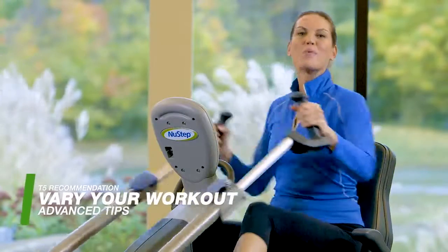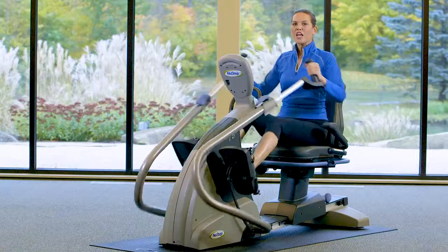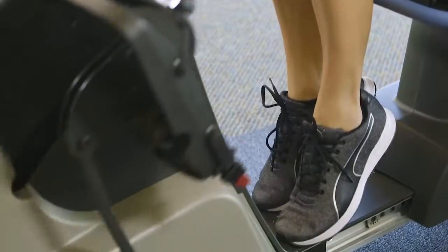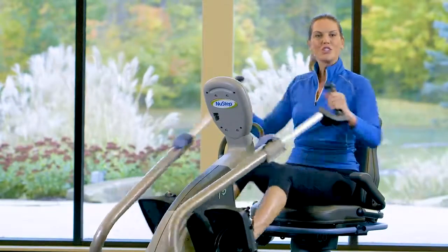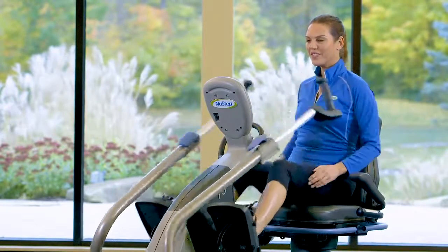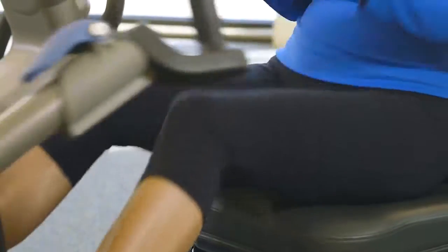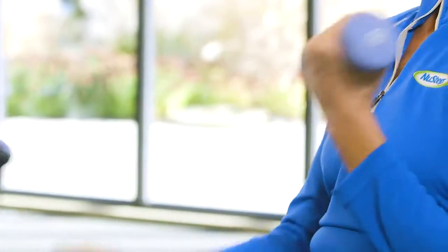I'm going to show you some fun ways to get more out of your new step cross trainer. If you want to work out just your upper body, drop your legs and adjust your resistance levels. If you want to challenge your lower body, just use your legs and let go. For more variety, incorporate weights while doing just legs. Just be sure to lower the NuStep cross trainer arms so you don't get bumped.